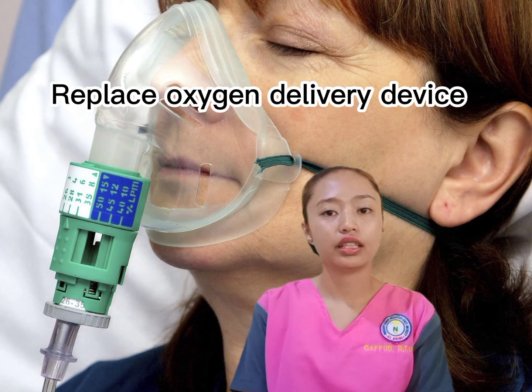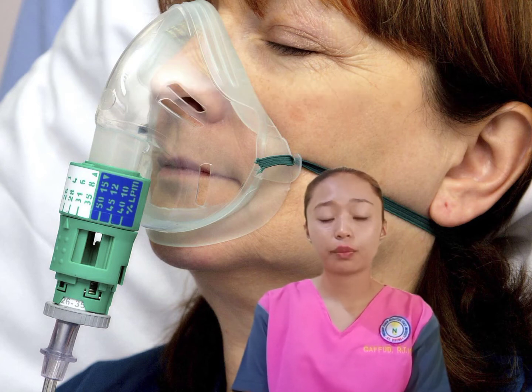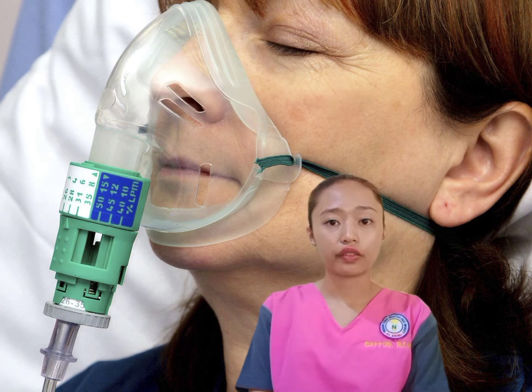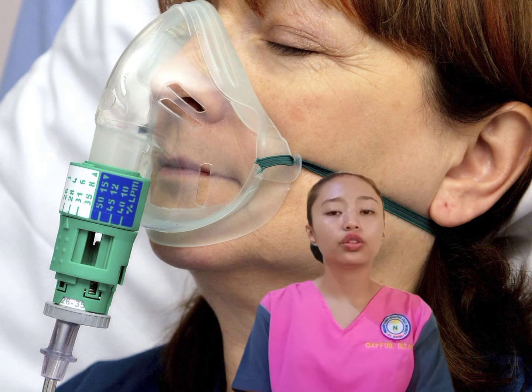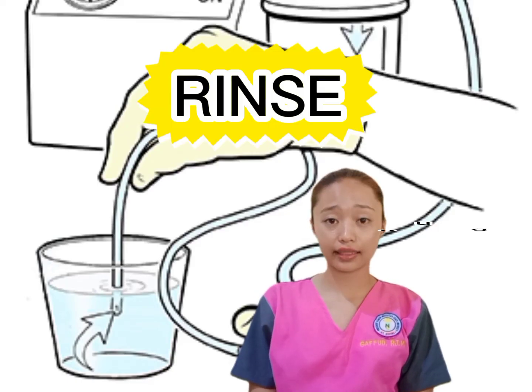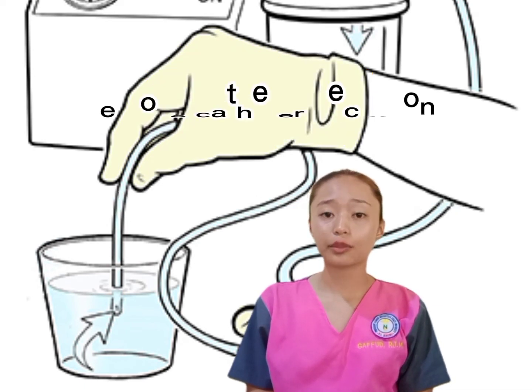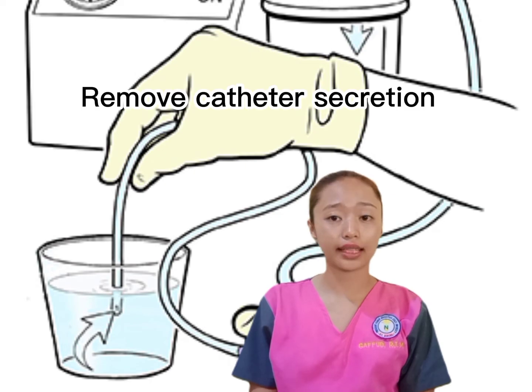Replace the oxygen delivery device. Hyperoxygenate between passes of the catheter and following the suctioning procedure. Replenish oxygen. Recovery to baseline partial pressure of oxygen takes 1 to 5 minutes. This reduces the incidence of hypoxemia and atelectasis. Rinse the catheter and connecting tubing with normal saline until clear. This process removes the secretions from the catheter.